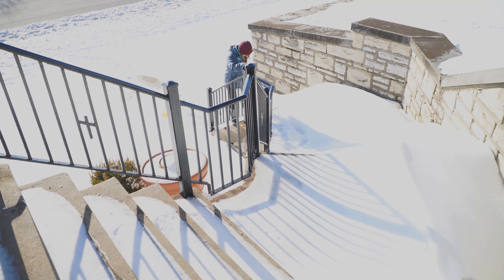If you're on snow that's not like a foot and a half thick and you're just walking on regular snow, it's basically like just regular walking — you just have to kick your knee out a little bit more to clear the snow. It's really not that bad at that depth.